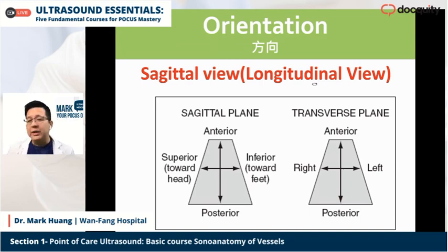The first orientation is the sagittal view. It means your probe is aligned in the sagittal view. When you see the screen, on your left side is the patient's head, and on your right side is the patient's feet, with the anterior and the posterior. When you rotate the probe, it will become the transverse plane, I mean the transverse view.